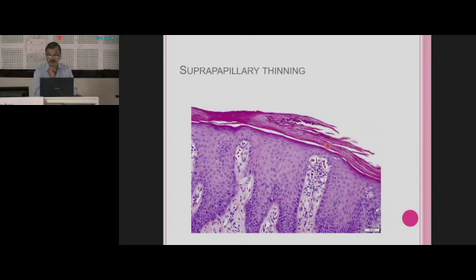Elongated dermal papillae contain dilated and tortuous capillaries, and these dilated capillaries in the papillary dermis lead to the secretion of plasma as well as the exocytosis of polymorphs in the keratin layer, which is one of the pathophysiologies of psoriasis.